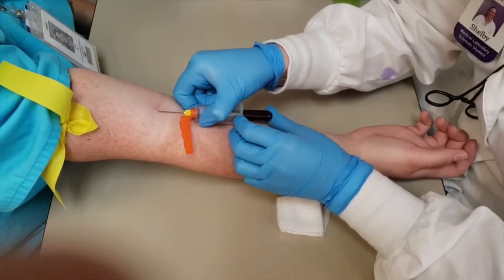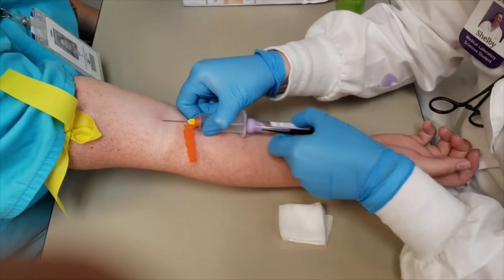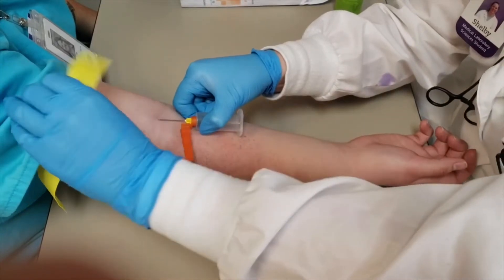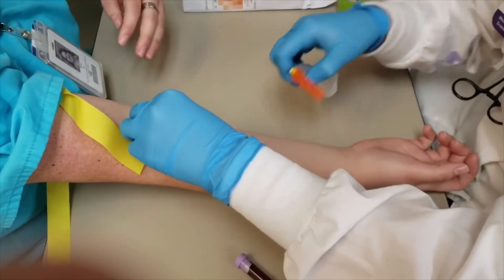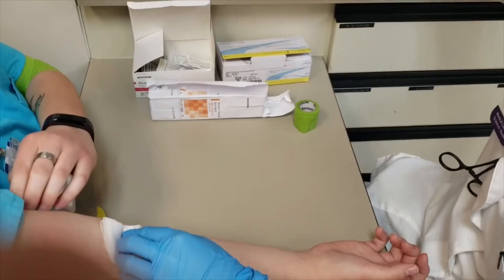And then you're going to fill your tube up. You're going to pull it out gently and invert it to mix the anticoagulant. Then you're going to take the tourniquet off, put your gauze on, and slowly take the needle out. Put your protective cap on and throw it in the sharps.